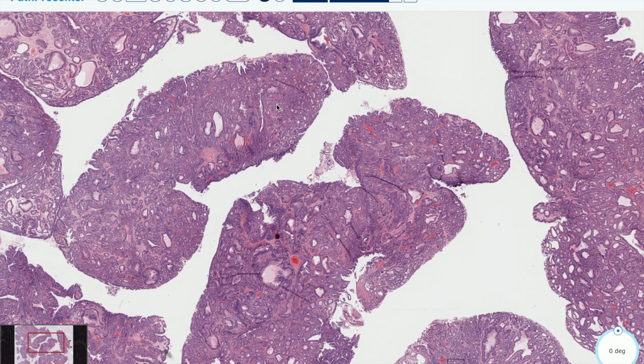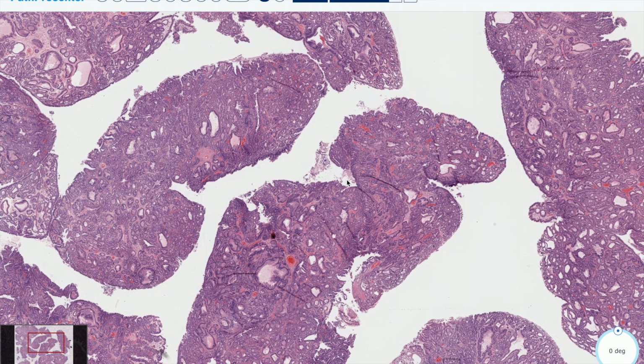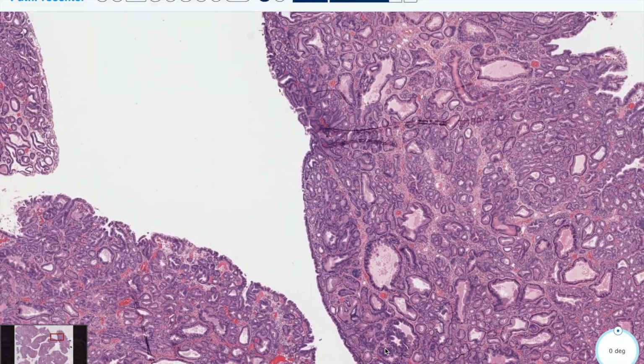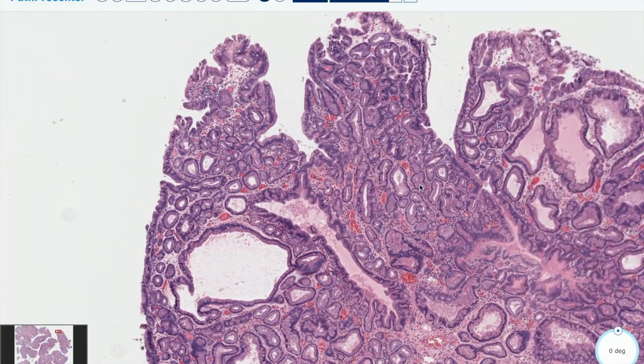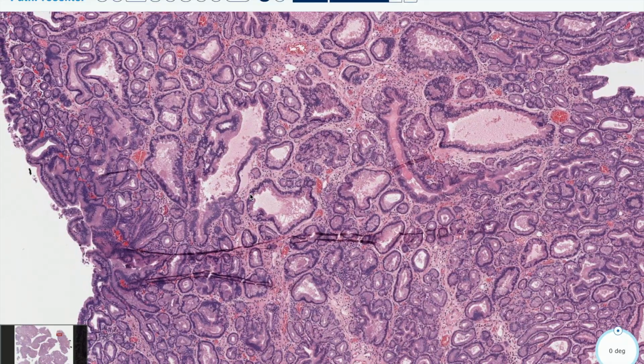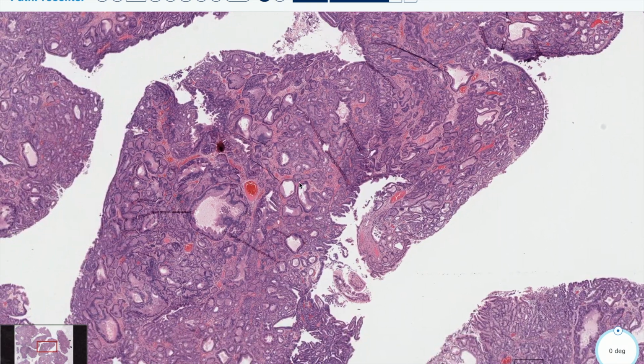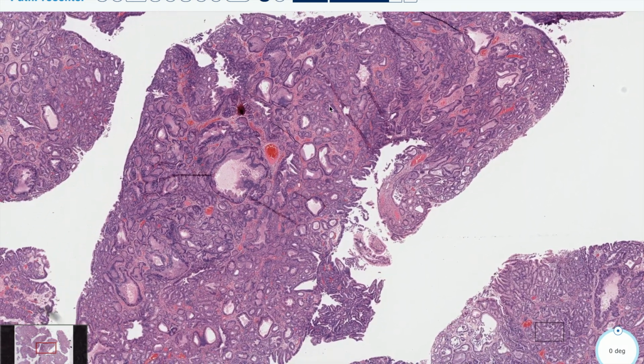These can commonly occur in the background of autoimmune gastritis, and also can occur in patients with familial adenomatous polyposis or Lynch syndrome. And these pyloric gland adenomas, to me, have an almost basophilic or blue appearance at low power, which is something that can get your mind thinking about a PGA, or a pyloric gland adenoma.